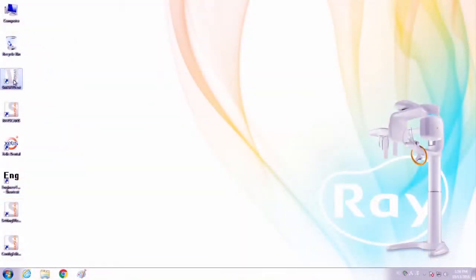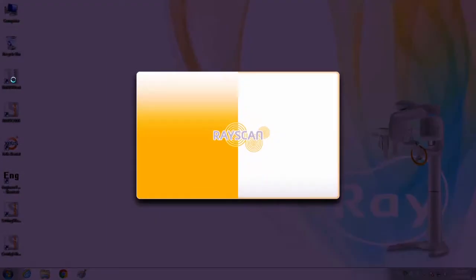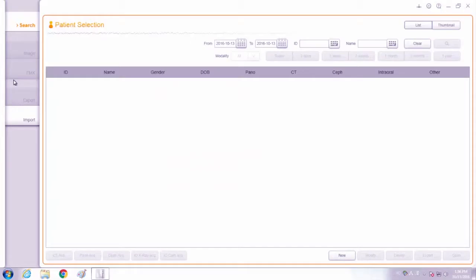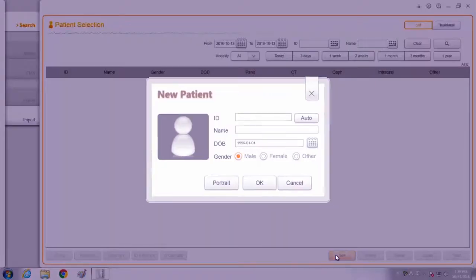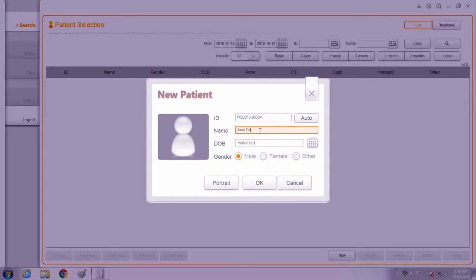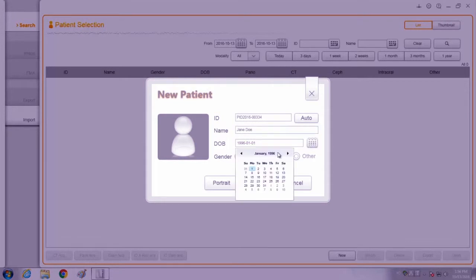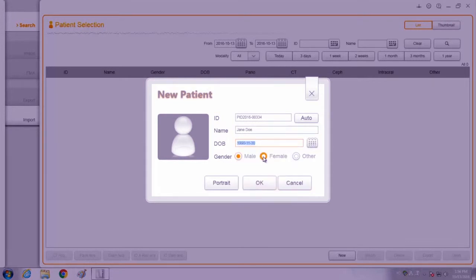Please execute SmartDent and register the patient information. Click the New button, and then enter the chart number, name, birthday, and gender of the patient. Then click OK to complete patient registration.